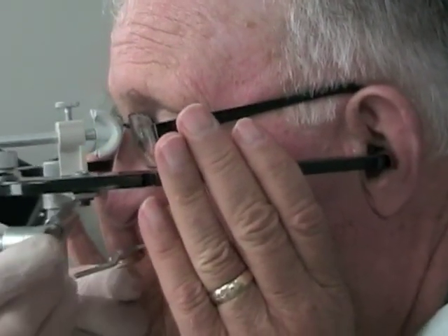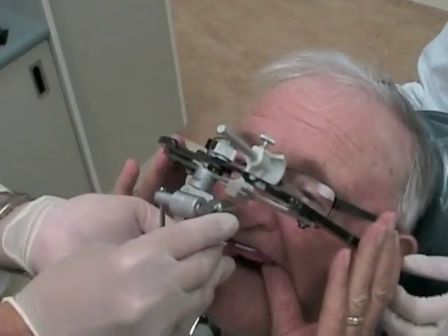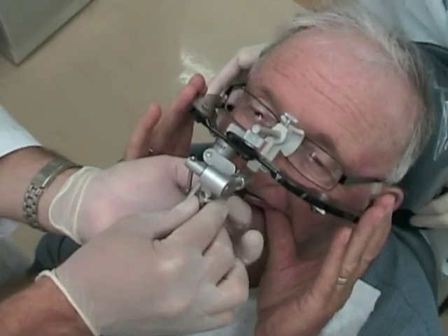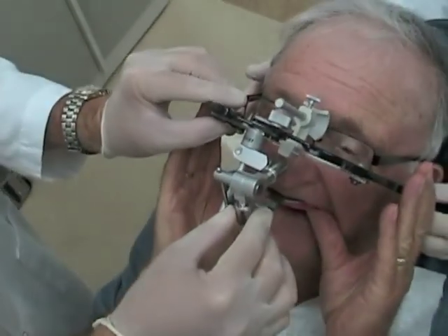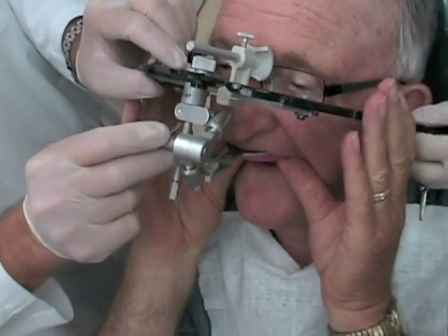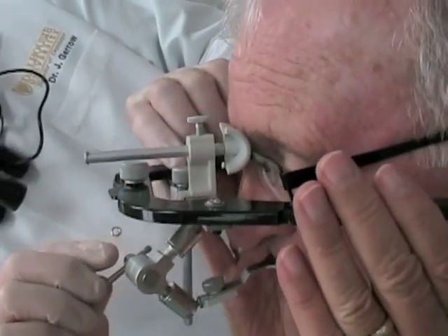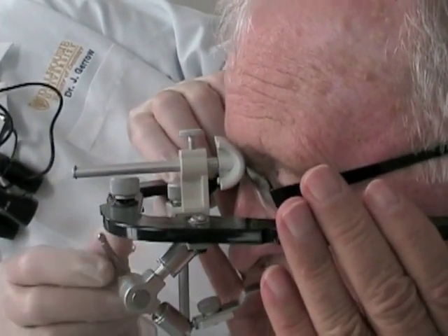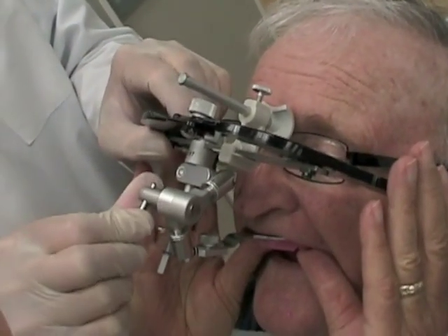Have the patient support the face bow with their fingers on the side and make sure that you can tighten the quick toggle assembly to the bite fork — make sure that's secure. Make sure everything is oriented properly, then use the single toggle bar at the anterior portion of the face bow to tighten. As you do this, use your other hand to help support and prevent torquing of the face bow on the patient's face.